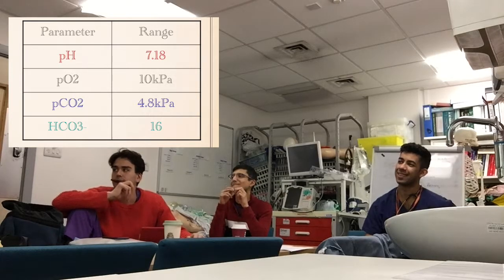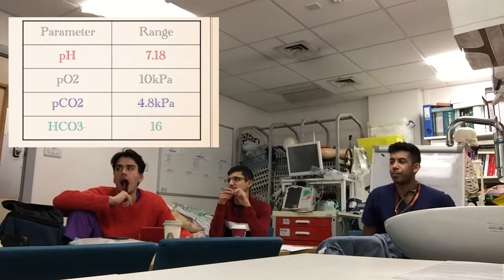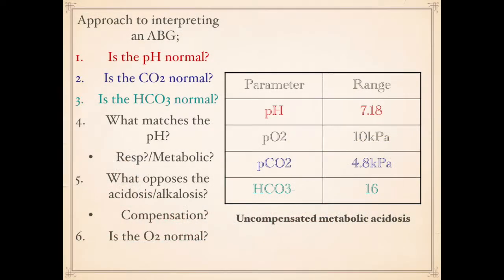The oxygen is okay. CO2 is okay as well, and the bicarbonate is a little bit low. So why don't you tell us what it is? Uncompensated metabolic. Very good. All right then. So again, you followed the process really well there. To be honest, that's what it's about. It's not about necessarily getting the answer, although you did, but you followed the process, which is really good.